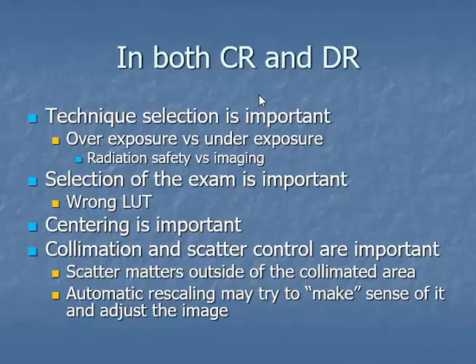So in addition to selecting the right technique, you also have to select the proper exam, so that whenever you set up your control panel, especially in a digital application in the DR world, if you tell your computer that you're shooting a set of ribs, and you set a technique that is more for a chest x-ray, and you just got lazy and you selected something that looked like thoracic viscera, and it turns out it's ribs. If you wanted to see chest x-ray, you're still going to see ribs.